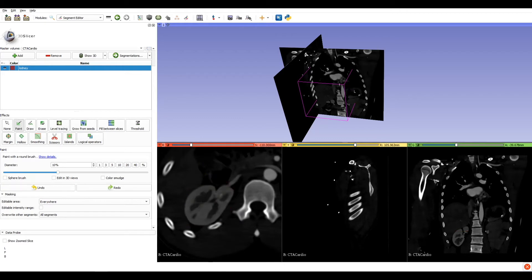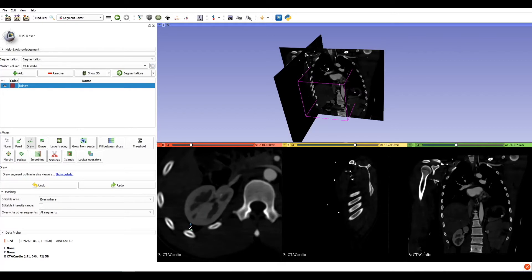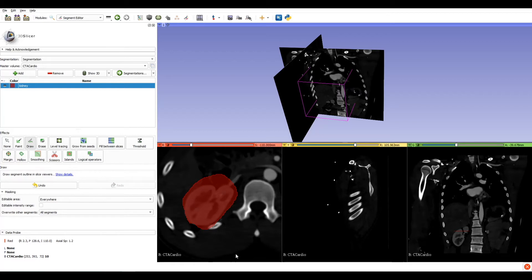Another tool that is quite similar to paint is draw. Draw affects only one slice at a time. By clicking on our slice with the mouse, we can go around the kidney, then hit enter on the keyboard, and this is our segmentation. But we can't do this operation on all the slices. Some datasets have thousands of slices, so we can't paint or draw on each of these slices.